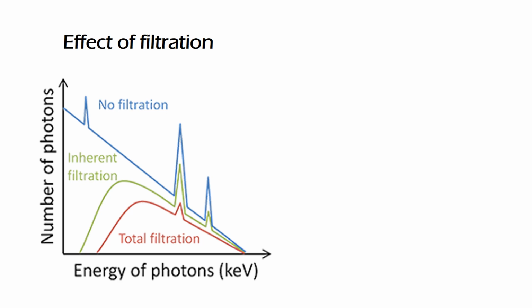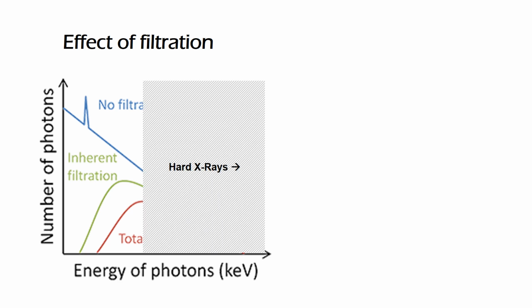Soft X-rays are low-energy X-rays, approximately below 10 keV. These X-rays have no contribution to X-ray imaging. On the contrary, they increase the skin dose to the patient and cause scatter, reducing the image sharpness. This is the soft X-ray range. Hard X-rays. Hard X-rays used in medical imaging are X-rays with energy typically in the range of 60 to 150 keV. This is the hard X-ray range.